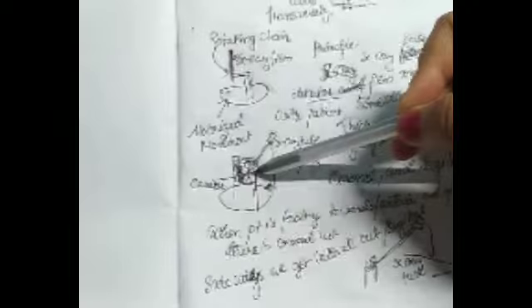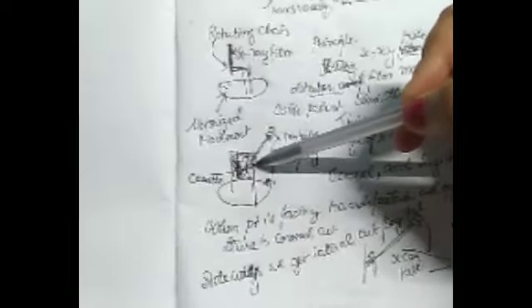Next, if you are going to take the image in sagittal section, that is right to left or left to right, you have to go sideways. Basically we place multiple cassettes here and images are taken with multiple exposures. So the patient moves in a circular pathway and multiple detectors or films are exposed to acquire the image. If the patient is facing anteriorly, you are going to get the anterior projection. Next you place the patient posteriorly and take the posterior projection. If you want to take the right section, you place the patient right way. If you want to take left, you take the left way.